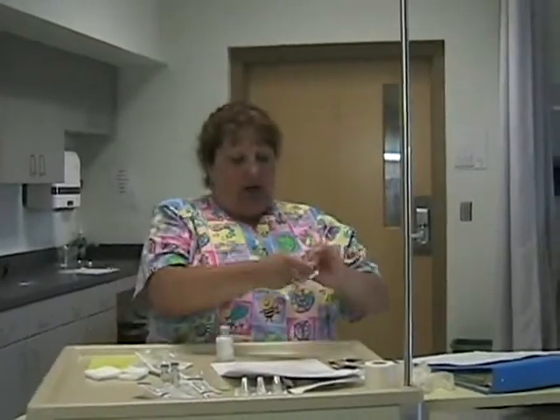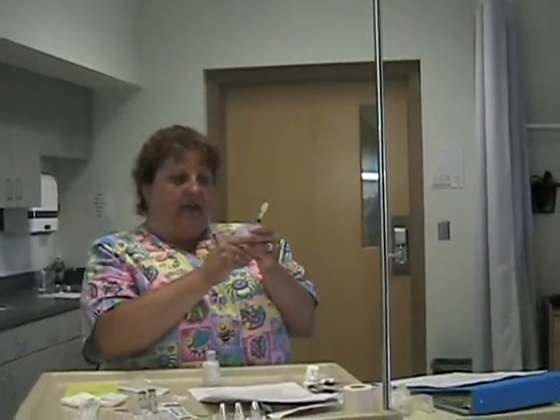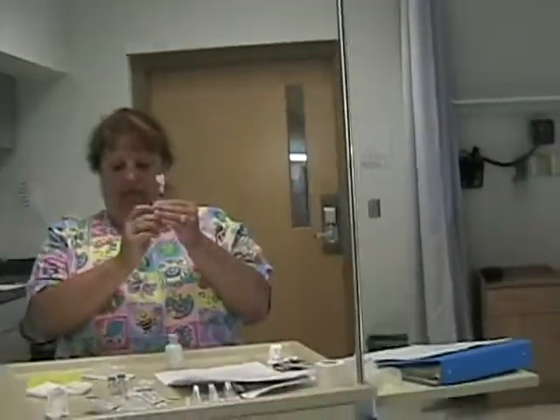Take an alcohol prep or your antimicrobial, give it a good wipe, and allow it to dry. Go ahead and remove my syringe, remove the cap from the needle. I'm going to be giving 1/2 of an ml, so I'm going to go ahead and pull my plunger down to the appropriate 1/2. Go ahead and hold. Also, I have my antimicrobial, which is already dried.